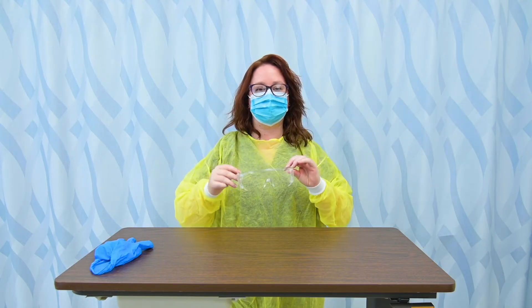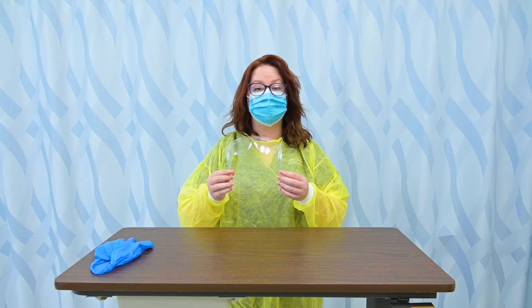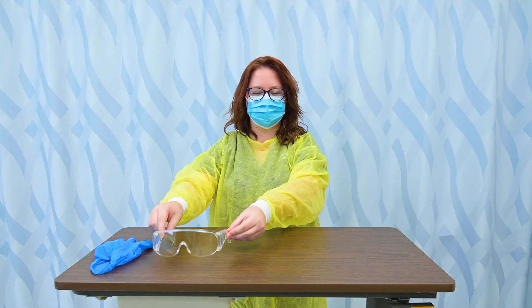Next, I'm going to remove my eyewear, and I want to touch as far back as I can. The front of my face is contaminated and exposed, so I'm going to touch way back here. I'm going to remove my eyewear, and I would either discard these or — a lot of facilities now have you clean them and reuse them — so I would at least set them aside.